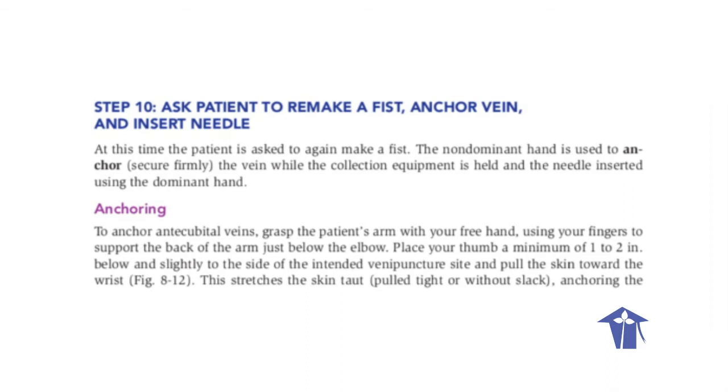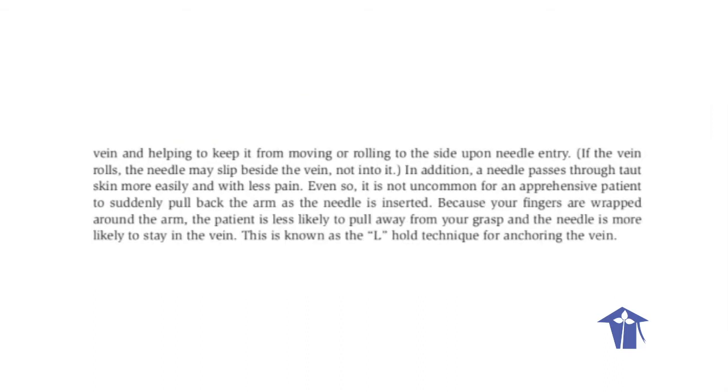Anchoring the vein helps to keep it from moving or rolling to the side upon needle entry. If the vein rolls, the needle may slip beside the vein, not into it. In addition, a needle passes through taut skin more easily and with less pain. Even so, it is not uncommon for an apprehensive patient to suddenly pull back the arm as the needle is inserted. Because your fingers are wrapped around the arm, the patient is less likely to pull away from your grasp and the needle is more likely to stay in the vein. This is known as the L-hold technique for anchoring the vein.